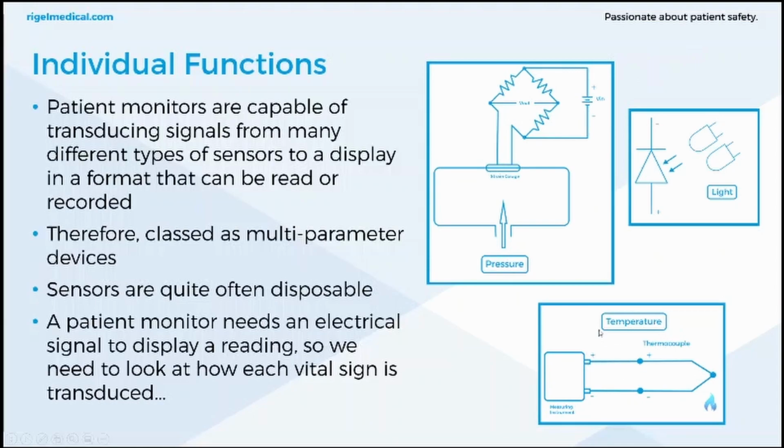Then we've got the bottom image as well. This is a thermocouple, and temperature changes induce a voltage change between the two different metals.